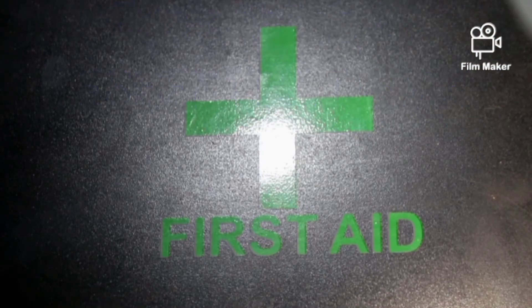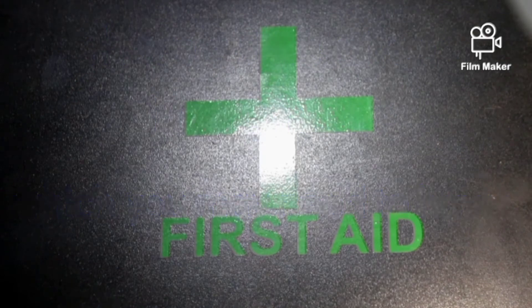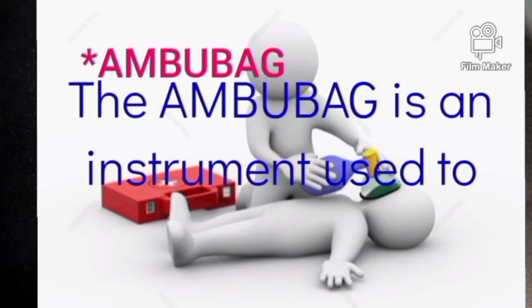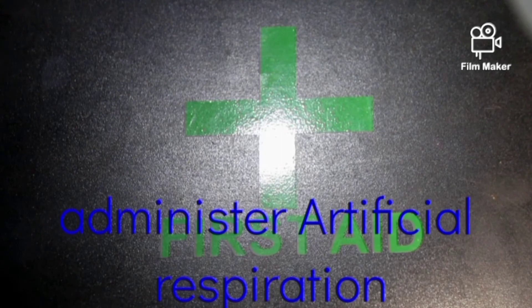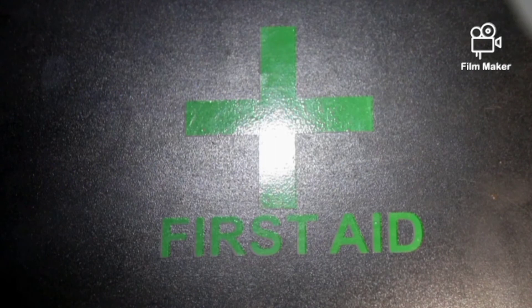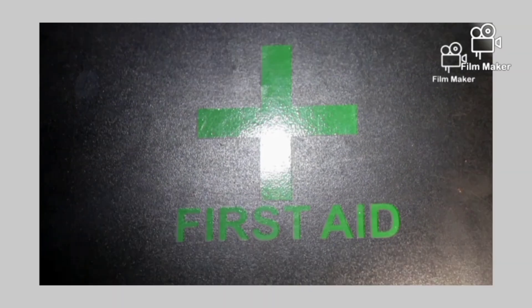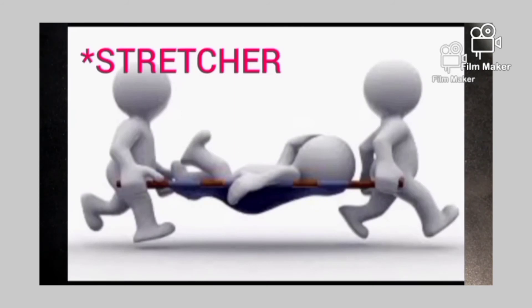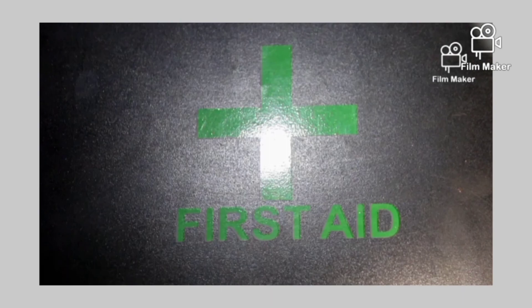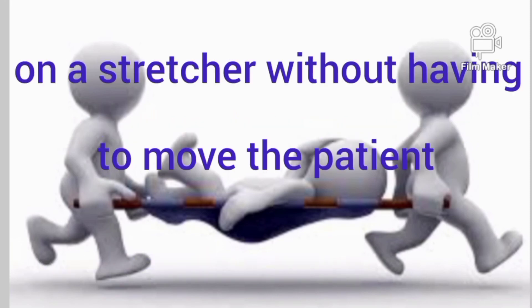Besides the 20 items discussed — the essential items found in the first aid box — there are some other instruments you may need. The ambu bag is an instrument used to administer artificial respiration like CPR, but it is easy to use in all cases including a patient exposed to gases, and is less stressful compared to other methods. You also need a shock blanket, as most accident patients go into shock and we need to treat it so the patient does not deteriorate. The other item is a stretcher — you need at least one to transport a patient safely and securely without unnecessary movement.